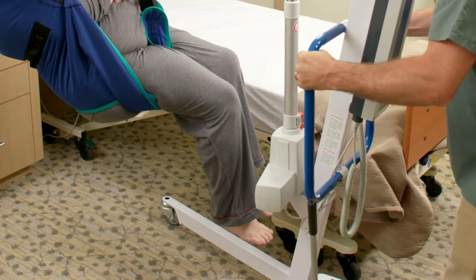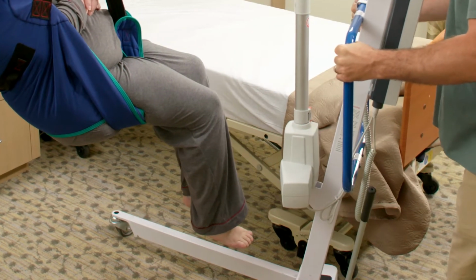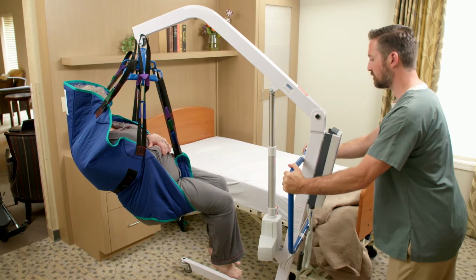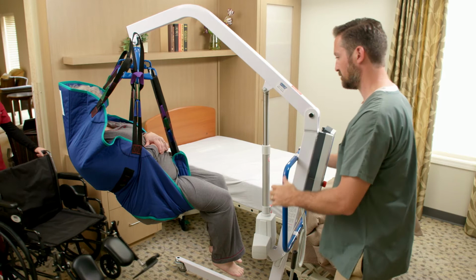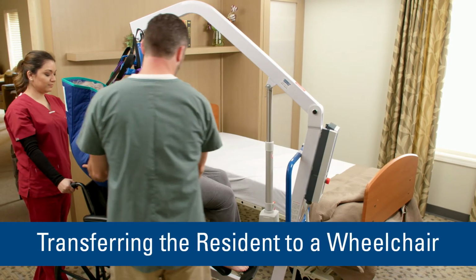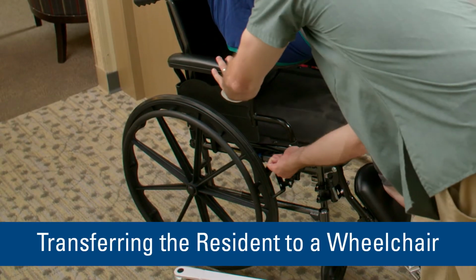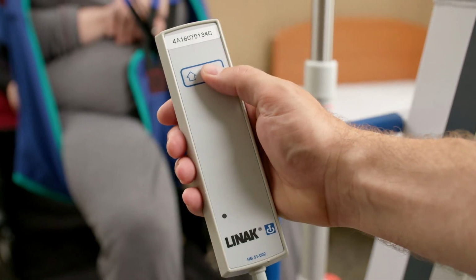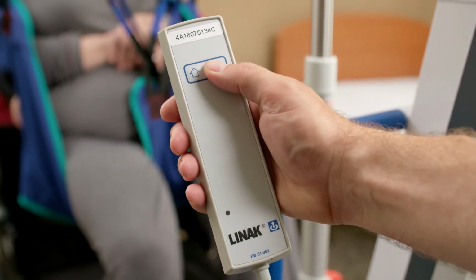When doing so, turn the resident so he or she faces the caregiver operating the lift. Check for obstructions before beginning to move a lift with a resident in the sling. Then move the wheelchair into position. To prevent movement of the wheelchair, engage the wheelchair's brakes. Begin to lower the resident by pressing the down arrow on the hand pendant.